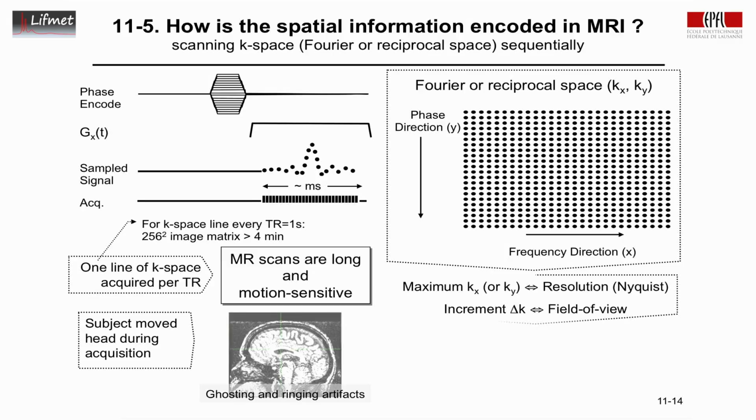So in this whole process, since what is being acquired is the Fourier transform of the object, the image reconstruction has no influence on the resolution. The resolution is uniform across the entire image, and also the sensitivity as such, once the signal is acquired, the reconstruction process induces a uniform sensitivity.